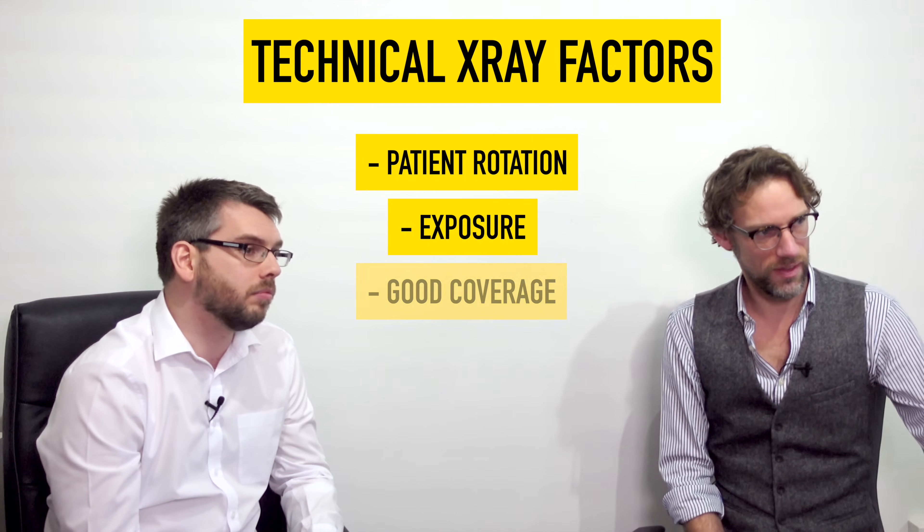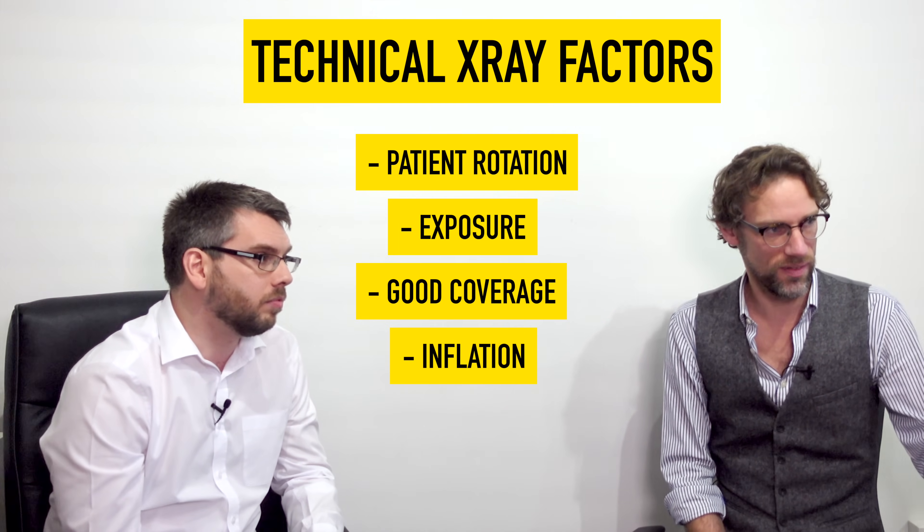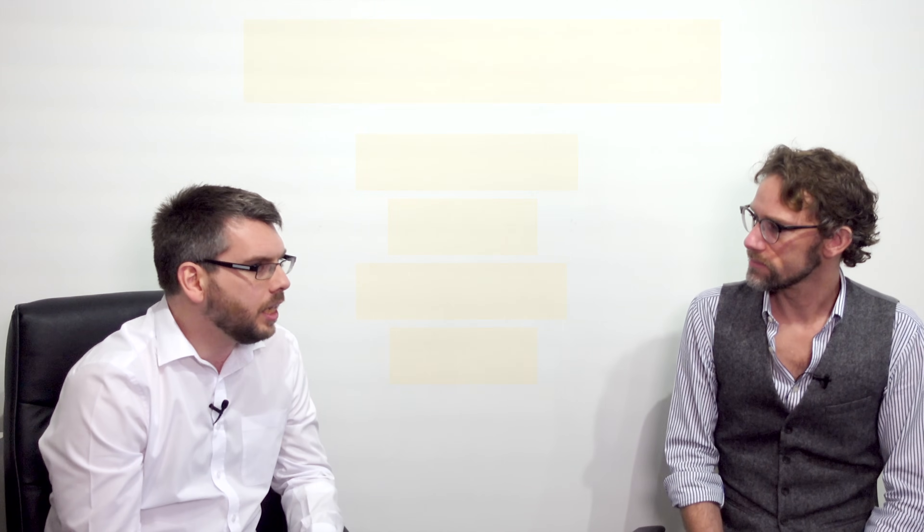There are also six anterior ribs — that's the minimum. This patient is young and healthy and has taken a very nice deep breath. So we've got rotation, exposure, everything is there, nicely inflated lungs, and we've counted down the ribs. I think we've done it for image quality — we can actually start talking about whether or not there's any pathology.